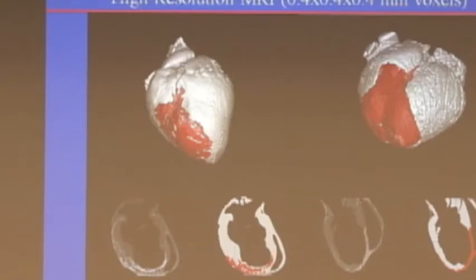So the way we've done it is kind of in between all that. We use an intensity level, but we also look at the images, because you can actually see the gray zone with your eye. And if the computer quantifies it the way we think it should be, then we accept it.